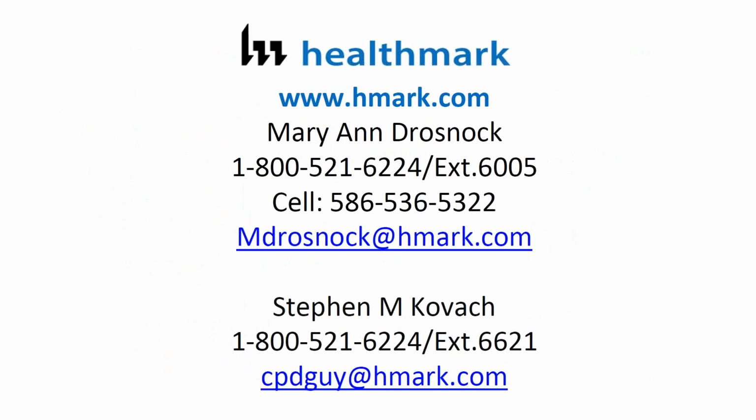What the AAMI committee decided to do was to put out a recommendation to do a risk assessment. So you have to look at the procedures in your facility to know what works best with your set of variables to have the best patient outcome. So I don't have a number of days associated with that, but really looking at your specific policies and procedures and variables in your facility to ensure that you're coming up with the best set of recommendations as far as how many days a scope can hang before it is reprocessed.